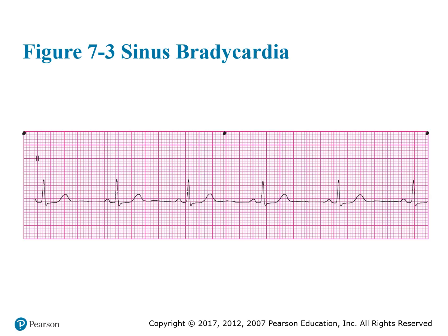We do have P's for every QRS. The distance between the P and QRS is kind of short, so that's good. QRSs don't look really wide. You have a T wave. Everything else looks good, so this is a normal rhythm. Everything looks good except he is bradycardic because he has a rate of less than 60 on this.